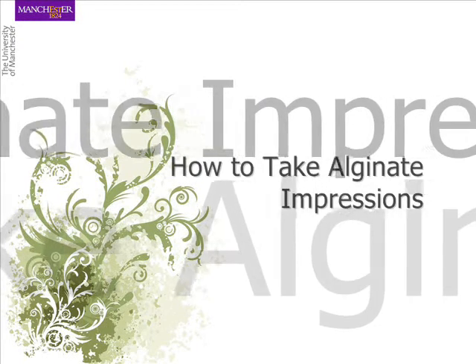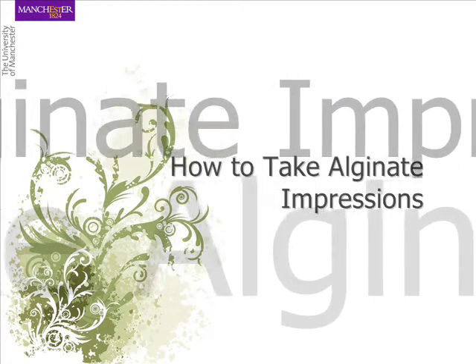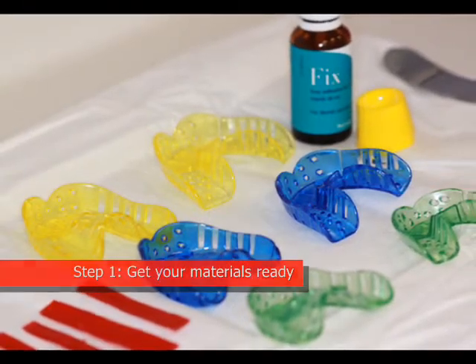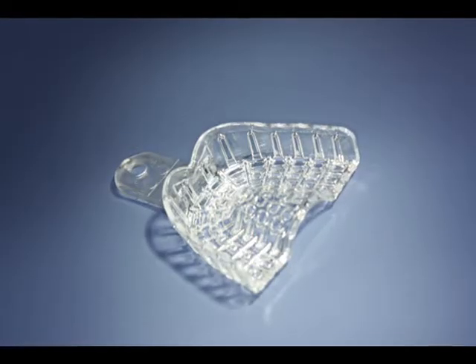In this video we are going to demonstrate how to take an alginate impression correctly. Prior to taking your alginate impression you must ensure all your materials and instruments are ready.